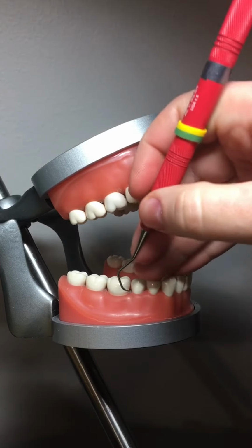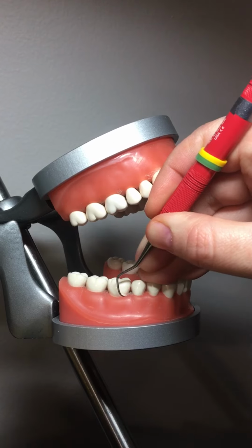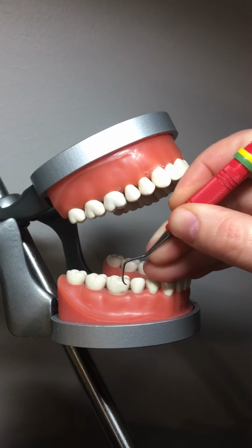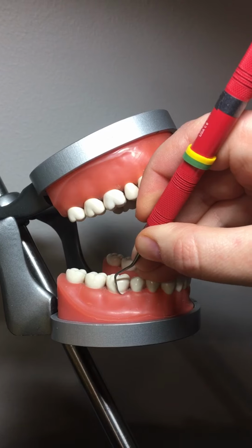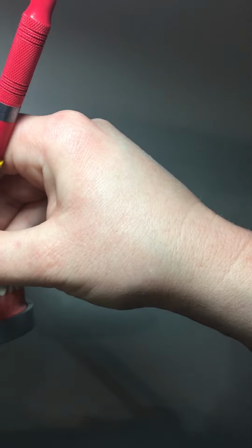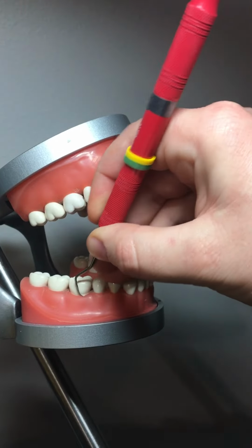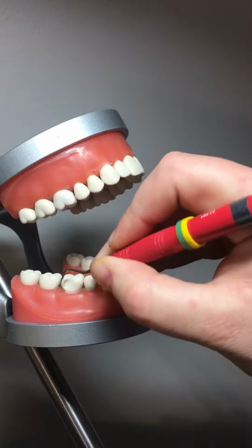Remember, to be effective with your calculus removal, you have to have enough lateral pressure in order to remove that piece of calculus away from the tooth. So you want to push against that tooth underneath that piece of calculus, and then using your wrist activation, like opening a door, you're going to pop that piece of calculus off. So you're going to go through with wrist activation, wrist activation, wrist activation, short biting strokes.